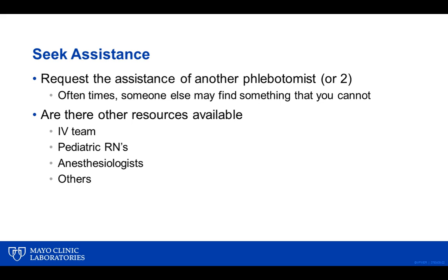To kind of clarify that, if you've ever donated blood, they actually give you a little rubber squeeze ball, and they ask you to randomly pump your fist. What we're doing there is we're facilitating blood flow. Keep in mind, we don't have a tourniquet on, and we're not drawing blood for analytical purposes. When we have a patient that's pumping their fist, yes, they're exaggerating blood flow, but we have a tourniquet in place. And what happens is we exaggerate the blood flow. It may allow you to find the vein. This is a perfect example of that.